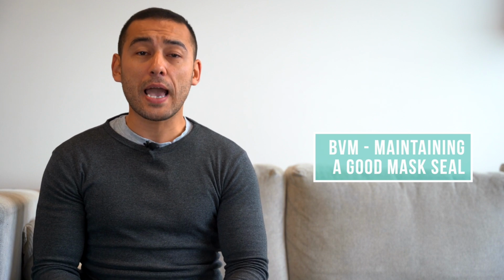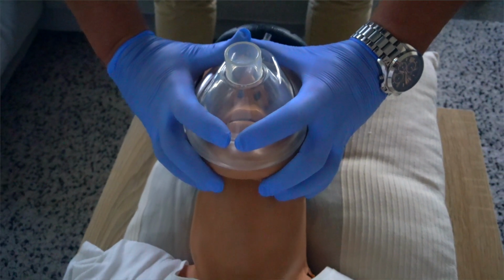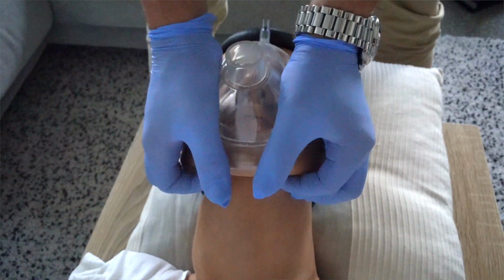To do this, an appropriately sized mask with a 2-person BVM technique should be employed using either the CE or thumbs down grip. In either case, be careful to not push the mask into the face, but rather lift the face into the mask. Even with good 2-person BVM technique, some patient characteristics make obtaining an effective mask seal challenging.